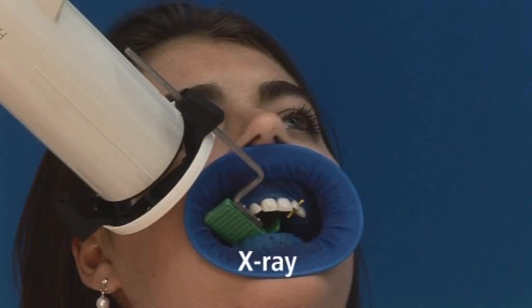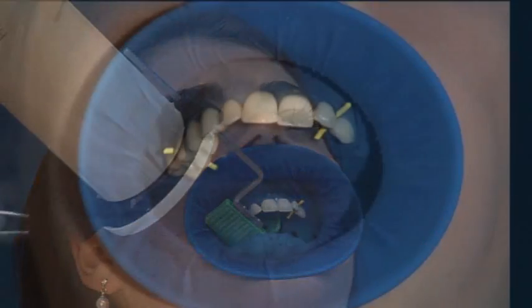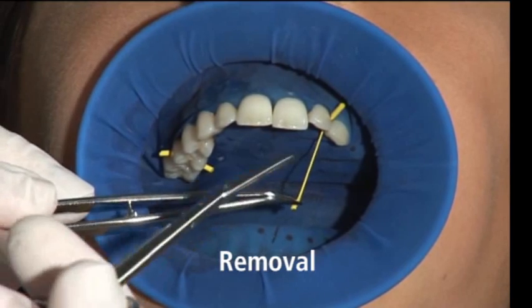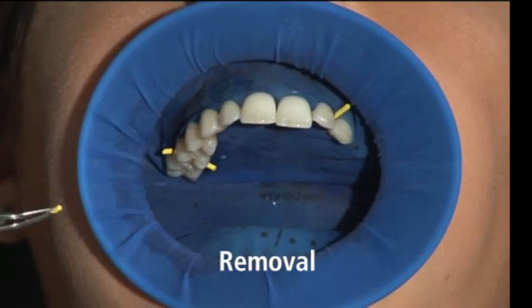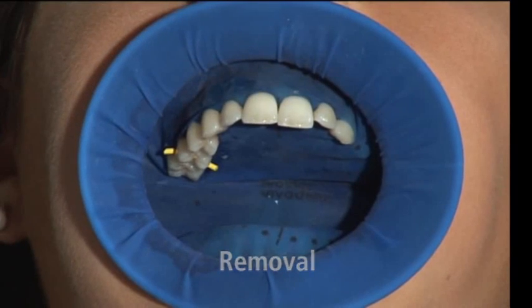Thanks to the Optredam's three-dimensional shape and high flexibility, x-rays can in most cases be taken with the Optredam in place, for example during endodontic treatments. To remove the wet jets, stretch them and cut them as closely to the tooth as possible. In this way, the wet jets can subsequently be removed with the forceps with great ease.